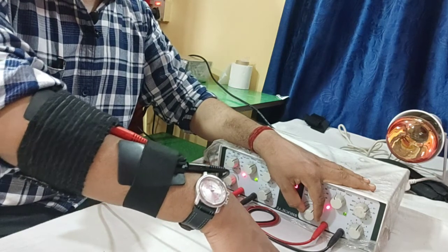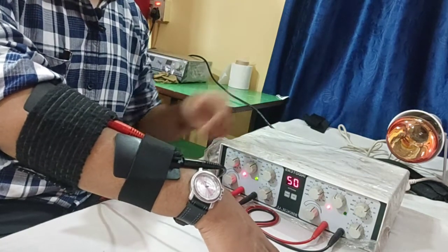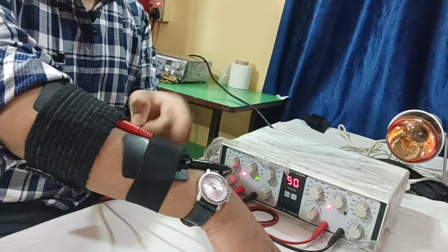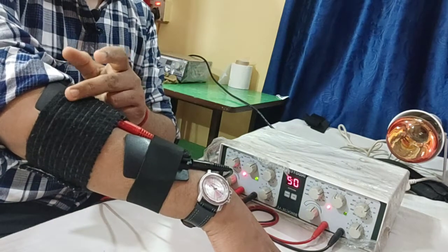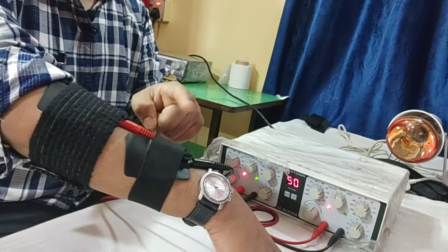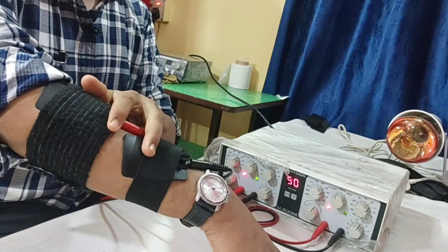intensity. And what is exactly happening in the modulated TENS, as we normally know, for the conventional or any other TENS, the current passes from black to red, that means from the cathode to anode. But for the polarity alteration or the modulation, it happens from black to red, red to black, from cathode to anode, anode to cathode. This is to decrease the adaptation.